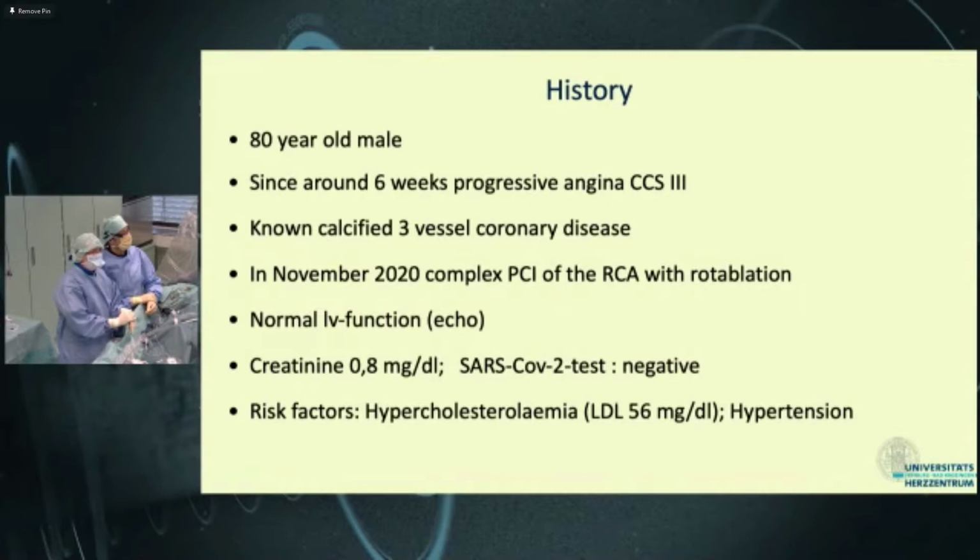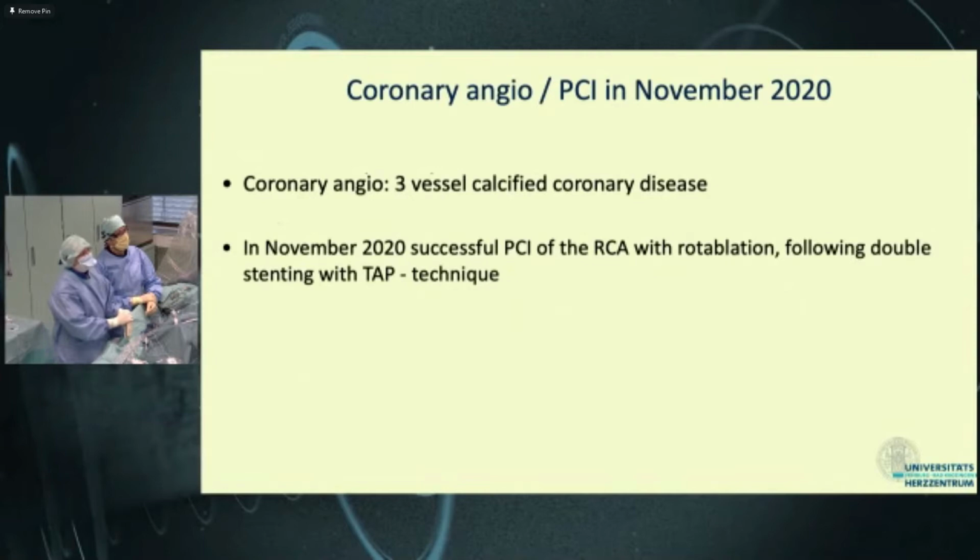The creatinine is 0.8, and as you can see, the SARS-CoV-2 test is negative. So risk factors: cholesterol is high, but now under control with statin therapy, and hypertension. Next slide. And the coronary angiogram you will see as the next step.